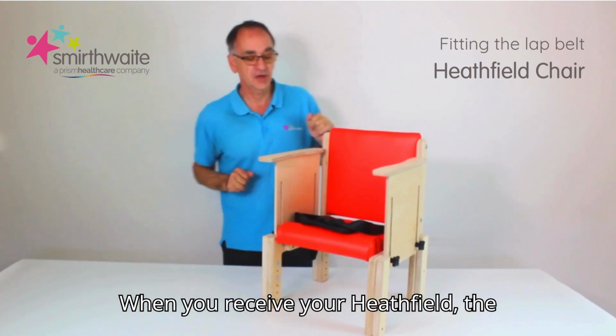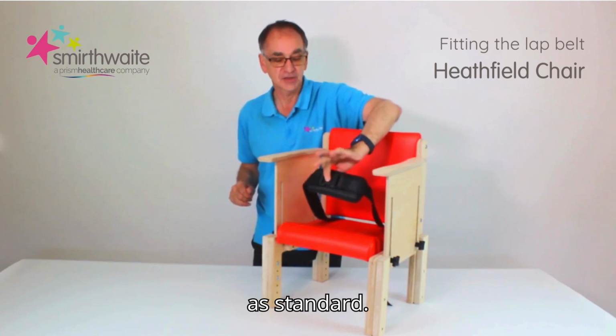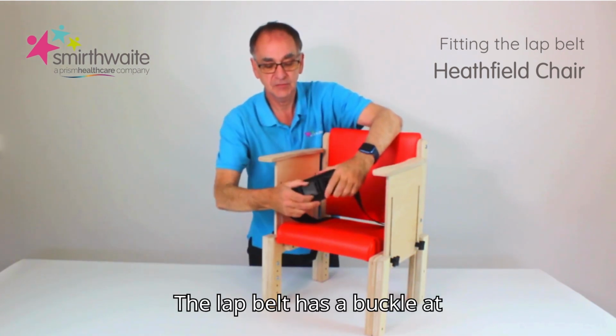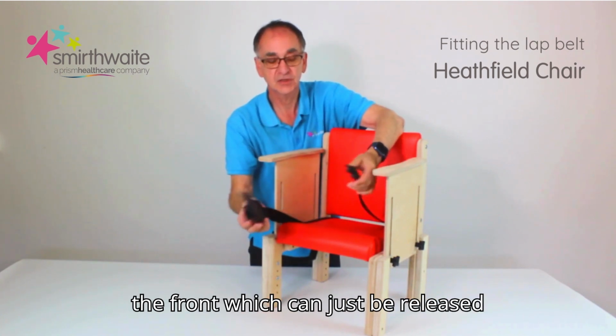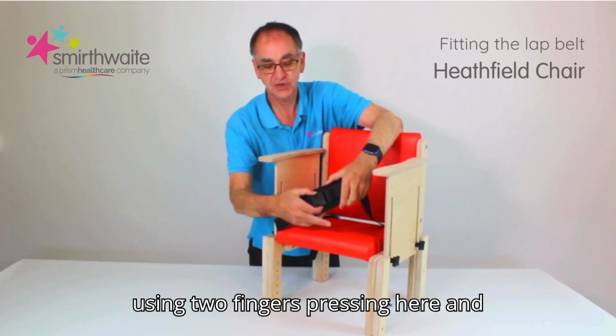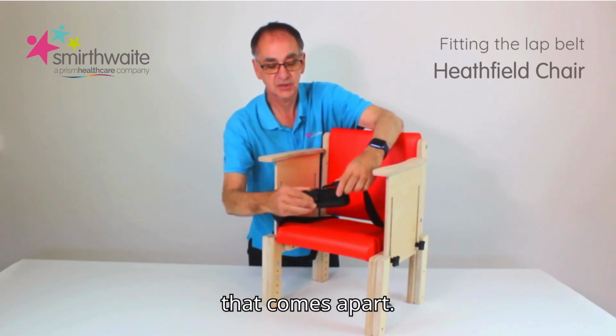When you receive your Heathfield, the Heathfield will come with a lap belt as standard. The lap belt has a buckle at the front which can just be released using 2 fingers, pressing here, and that comes apart.